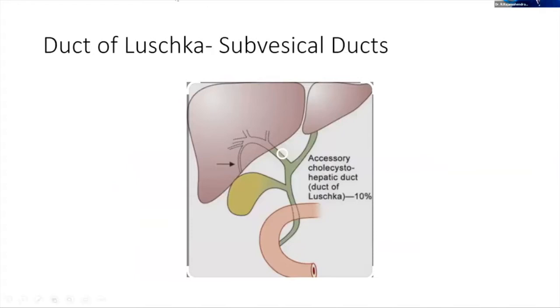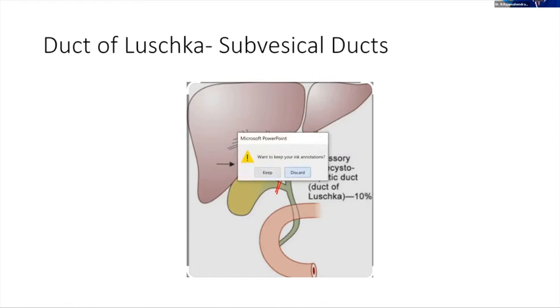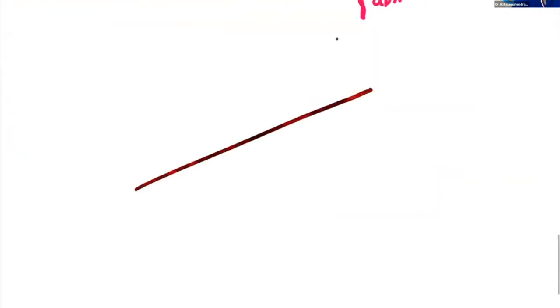One another important thing which always causes problems while we are doing laparoscopic cholecystectomy is clamping the cystic duct. I'll show you as a diagram, you'll understand much better. Sometimes there is one anomaly, a very commonly seen anomaly. So this is the liver. Now I have clamped the cystic duct. I have clipped the cystic artery also very nicely. I'm sure there is no other injury.